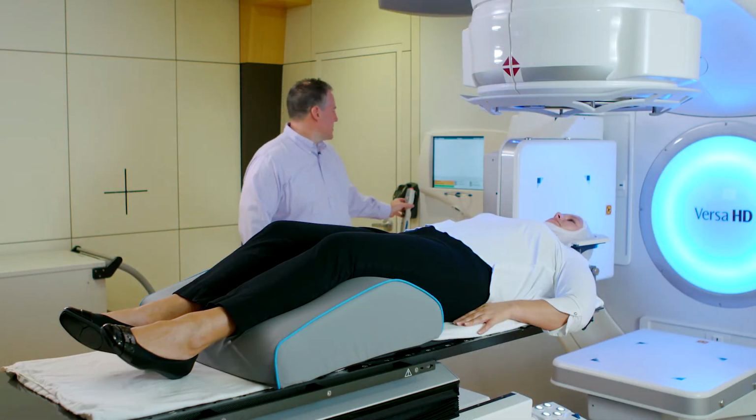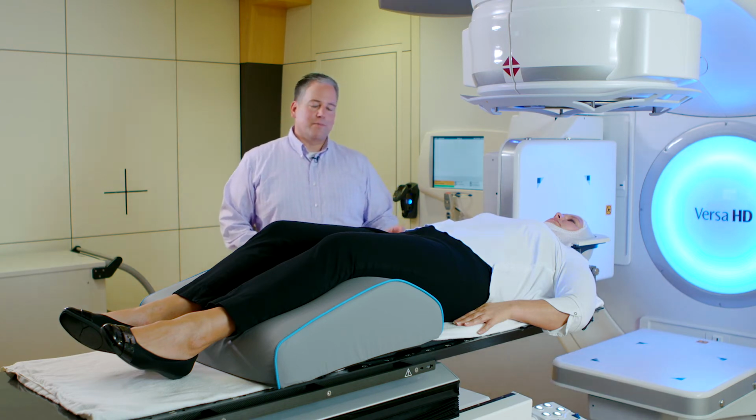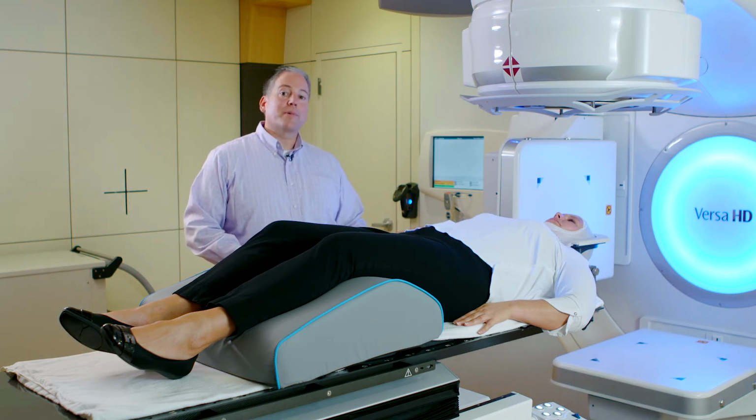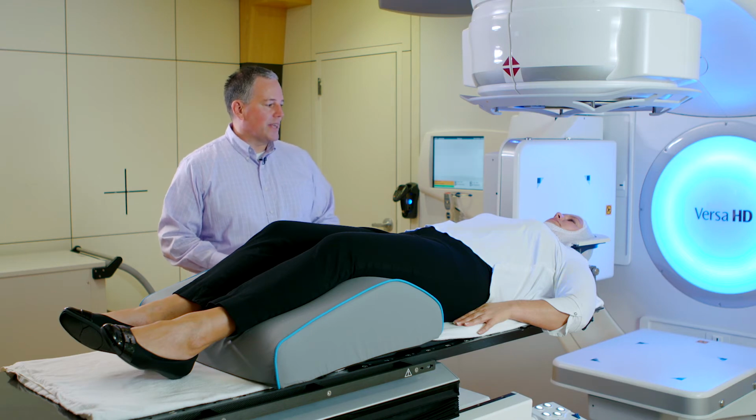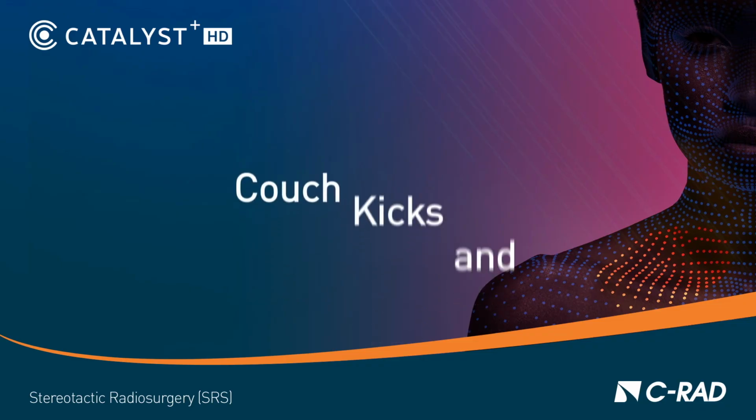Now our patient is in position. Catalyst will do another calculation that will make sure that the patient is properly positioned, fine-tuned, and then we'll be ready to do our imaging and treatment as well.